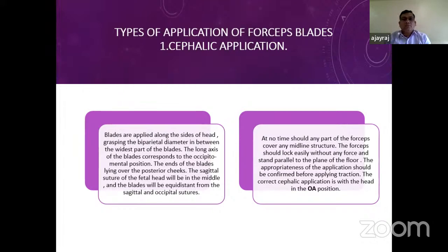At no time should any part of the forceps cover any midline structure. Forceps should not be applied to the midline of any structure. They should be applied on the sides of the head of the fetus.